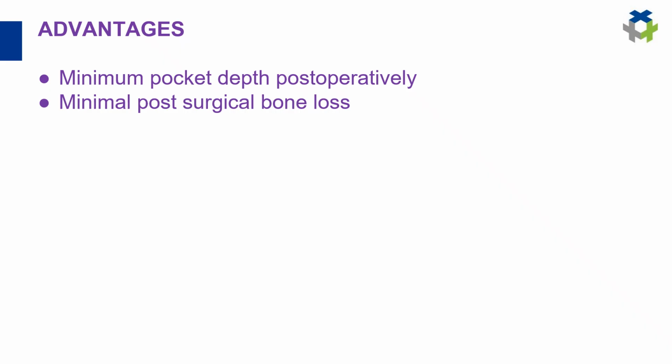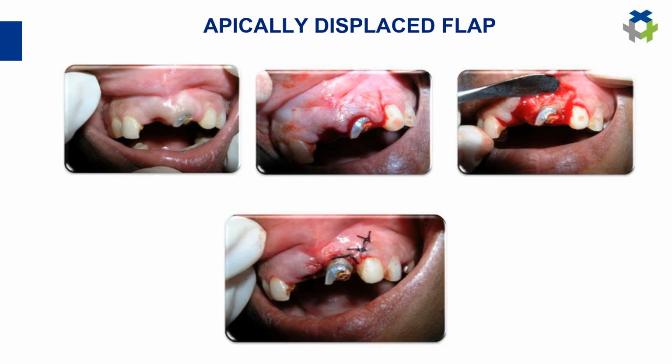So the advantage of an apically displaced flap is it results in minimal pocket depth post-operatively and minimal post-surgical bone loss. So this is an apically displaced flap.